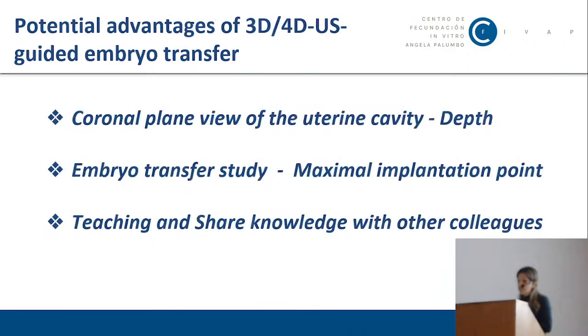In summary, evidence is not yet available to demonstrate improved results with 3D ultrasound, and further research is needed. But we can see the potential advantages of 3D and 4D ultrasound guidance, which include the capability to evaluate the depth and assess the coronal plane view.